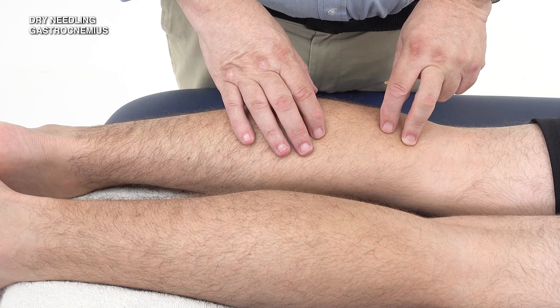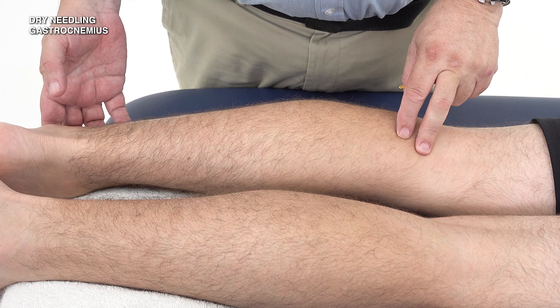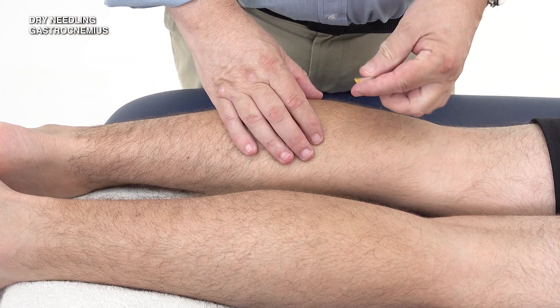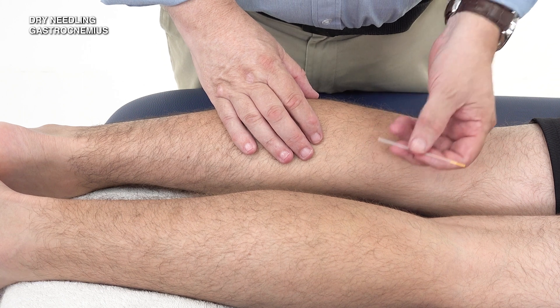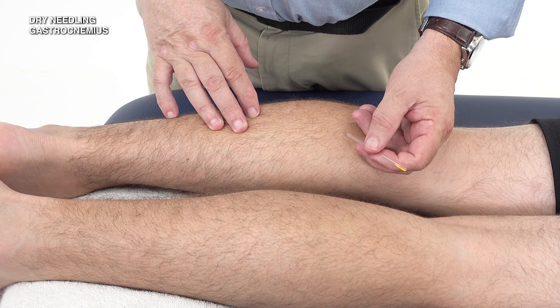For the gastrocnemius, the patient will be lying prone with the ankle supported with a towel, which makes it a little bit more comfortable rather than having it pushing on the edge of the bed. We will use a 30 millimeter needle — sometimes you can use a bit bigger, but a 30 millimeter needle will suffice.